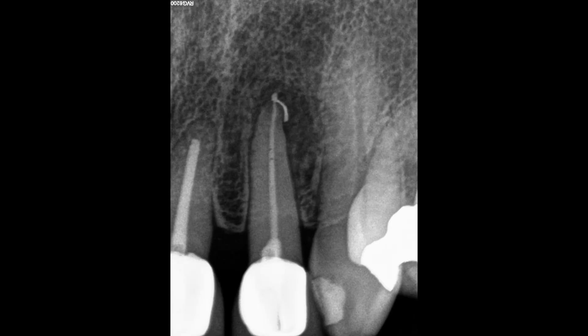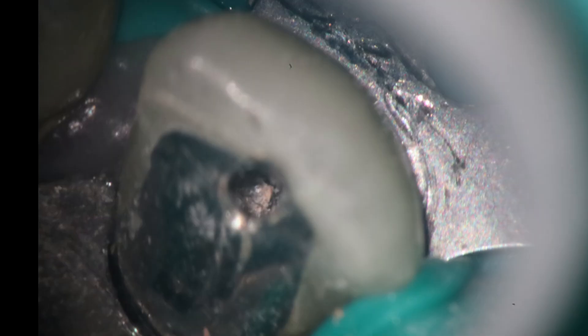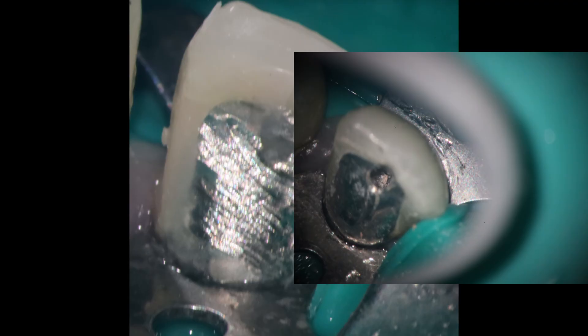This ended up taking under nine minutes. Anterior teeth should not take you forever. I saw her back a month later and finished it up — we were able to keep everything nice and small. When we take our anterior scans we'll often pick up other things, and sure enough tooth seven also had a little finding on the scan, so we took care of that one as well. I was able to keep that access a lot smaller because I was the first one in. Here is what the access looked like on tooth 10, and here is what it looked like on tooth 7 — so much smaller, conserving a lot more tooth structure.